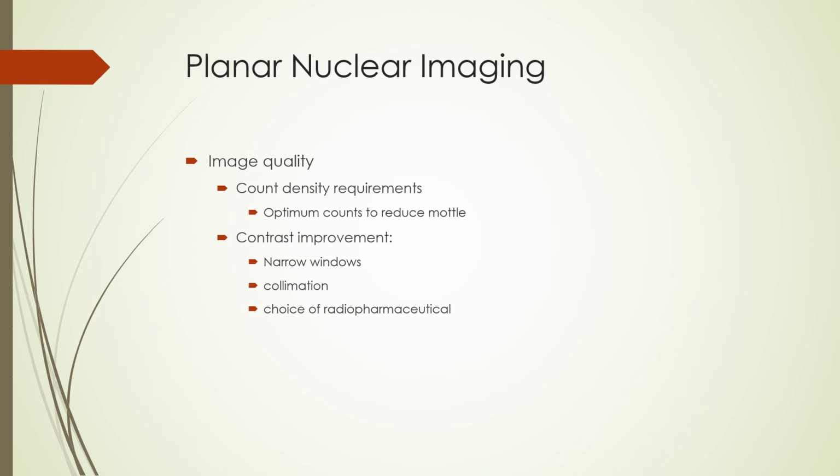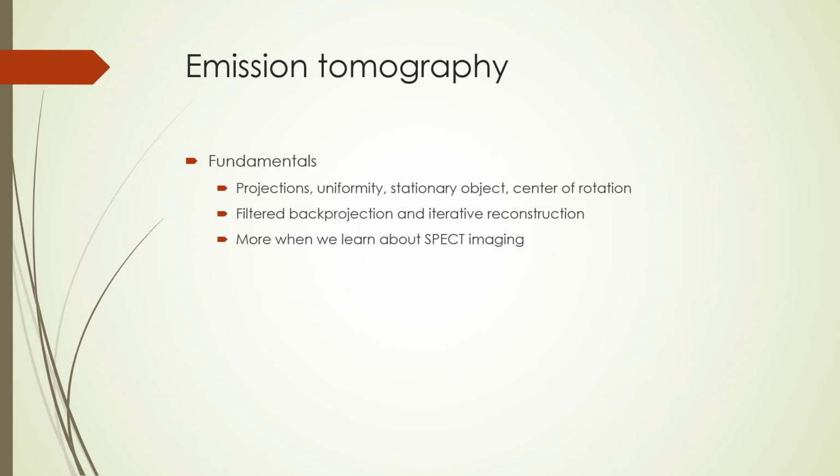Also, the choice of collimator can improve image quality. A high-resolution collimator can be used to improve spatial resolution, and properly matching low-energy radionuclides to low-energy collimators also improves image quality. Another type of image acquisition in nuclear medicine involves emission tomography.